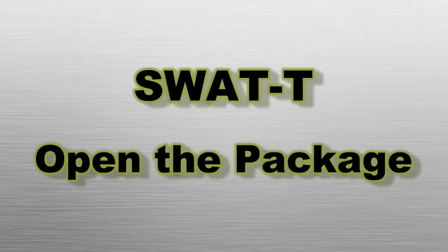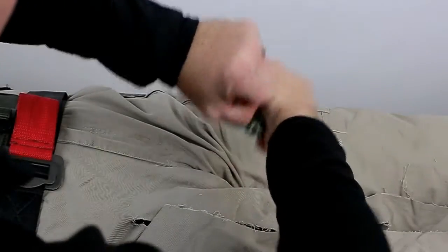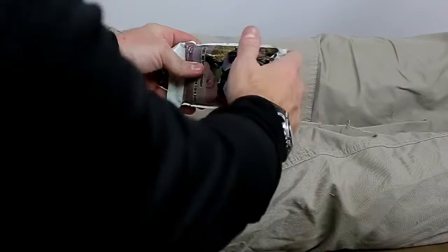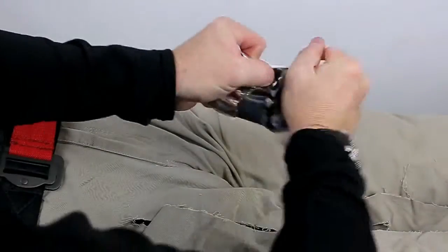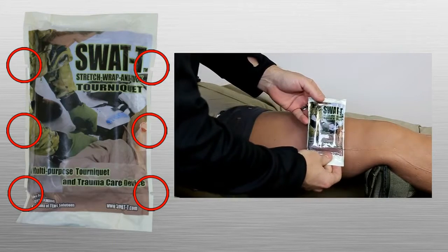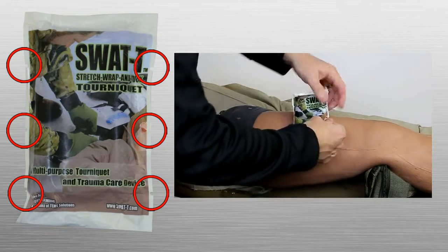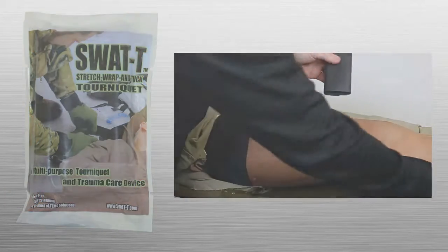Open the package. The twist-snap method of opening has been found to be the simplest and fastest method of removing the SWAT-T from its packaging. Tightly grip the SWAT-T overhand with thumbs to the center and turn your hands forcefully in opposite directions. The SWAT-T packaging also has 6 tear points located on the sides of the package, allowing for traditional horizontal opening at the top, bottom, or center of the package.